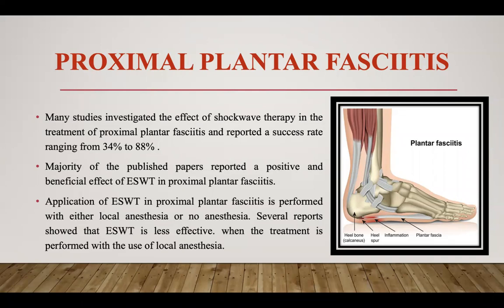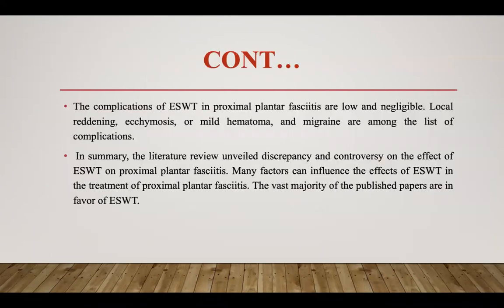Several reports show that extracorporeal shockwave therapy is less effective when the treatment is performed with the use of local anesthesia. This figure shows plantar fasciitis, where the heel bone, the calcaneus, and the heel suffer inflammation under the feet, causing plantar fasciitis. That is a clinical application of shockwave that helps to improve your heel pain and inflammation.